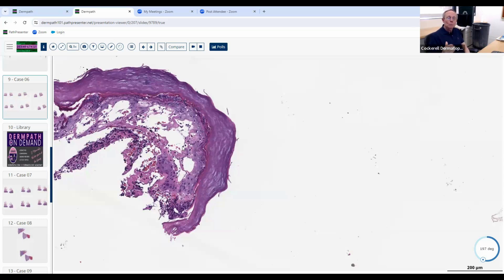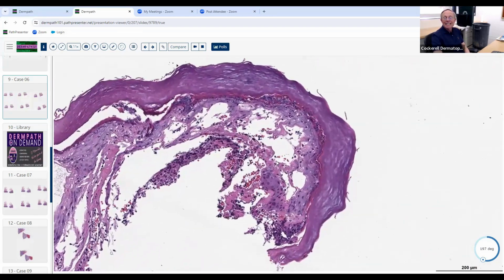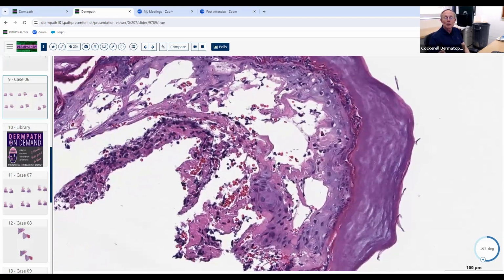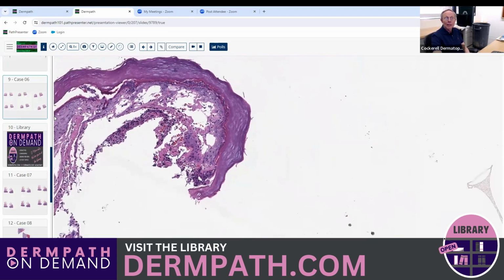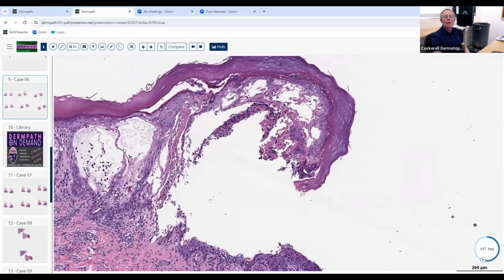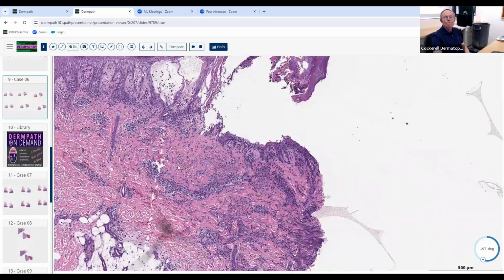So the same condition, non-photo exacerbated, tends to be more superficial. If it's superficial and deep, think, maybe it's photo exacerbated also. But here we're dealing with Hydroa Vacciniforme, ballooning degeneration induced by sunlight, induced by ultraviolet light. So again, that's another cause of ballooning degeneration, the photo-related process.